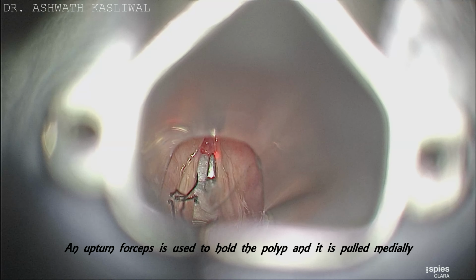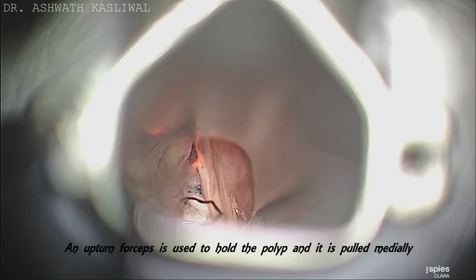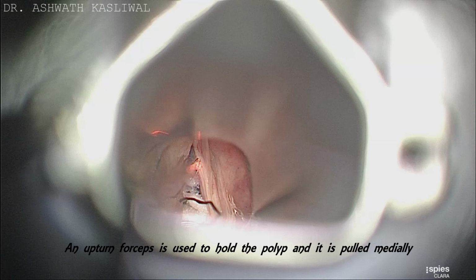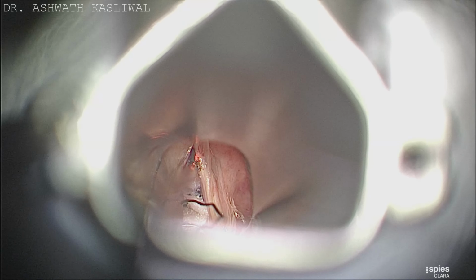An upturn forceps is used to hold the polyp and it is pulled medially. So the dissection is started just lateral to the polyp.